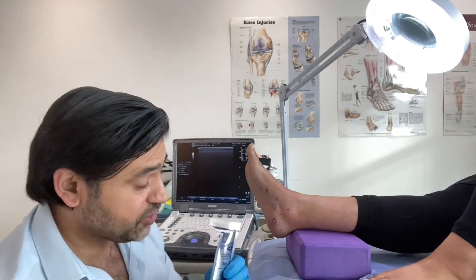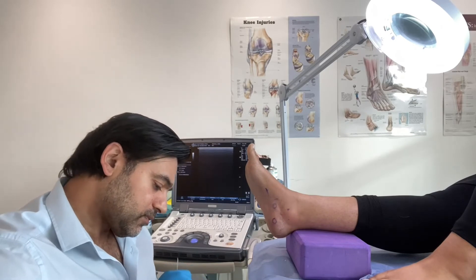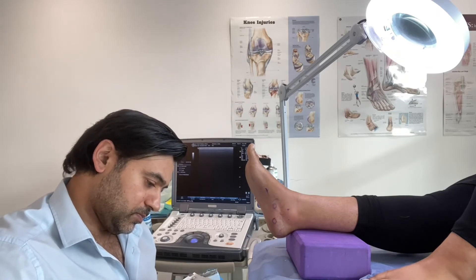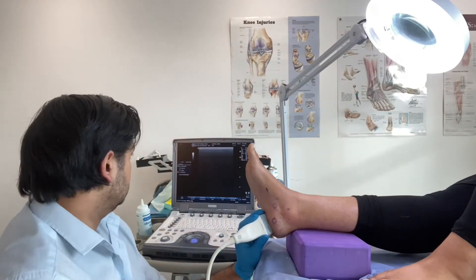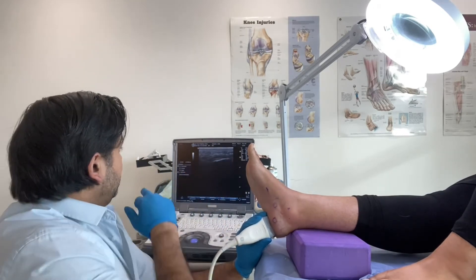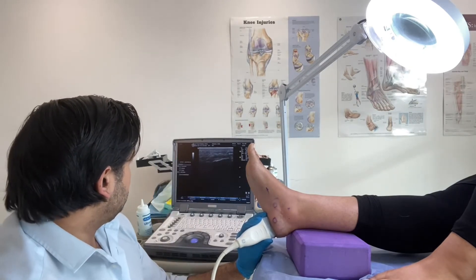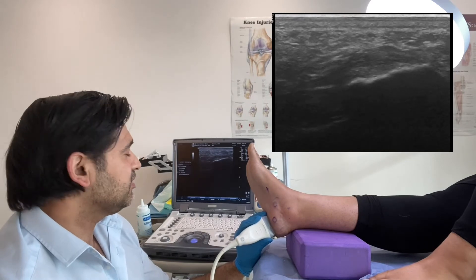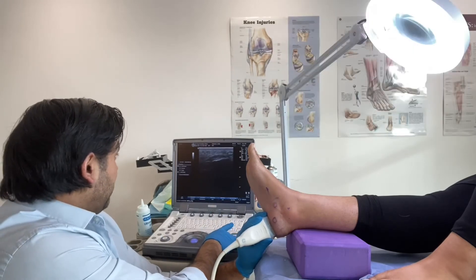Take some sterile ultrasound gel. What you can see there is the calcaneus and the plantar fascia, which has got a lot of fasciosis — so there's degeneration. How long have you had this heel pain? Only over two years. Two years of this going on, so hence it can get quite degenerative.